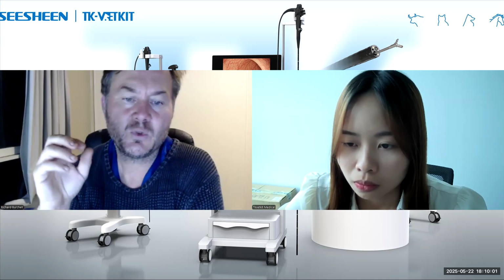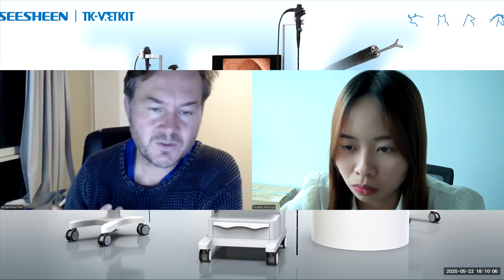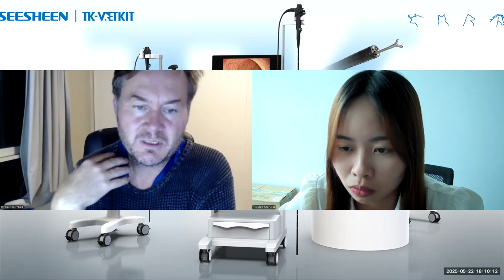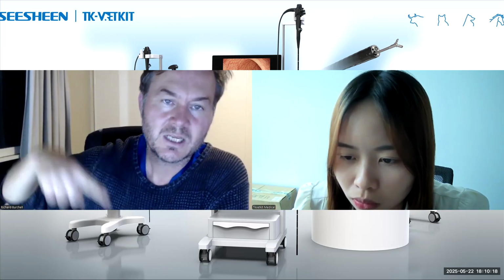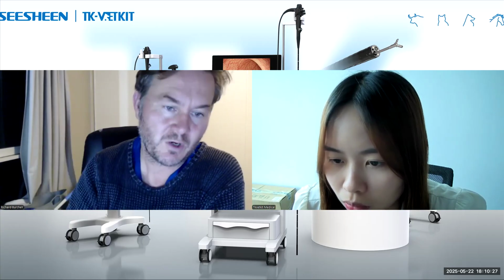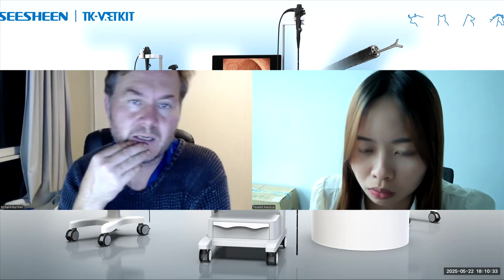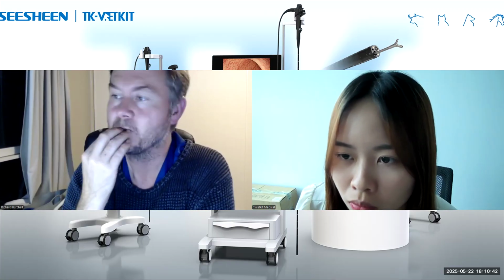But in broad terms, you would obviously do things like pre-oxygenation. Make sure that they have oxygen. So if you are concerned about oxygen and you don't have the ability to have the ET tube delivering oxygen, then you can place a feeding tube into the trachea with oxygen connected to it and scope alongside that. Or you can connect the oxygen directly to your endoscope and flush oxygen through the working channel of the endoscope to provide oxygen that way. And then under those circumstances, probably the most important thing is that your anesthetic is as short as it possibly can be. So you've got to be quick.